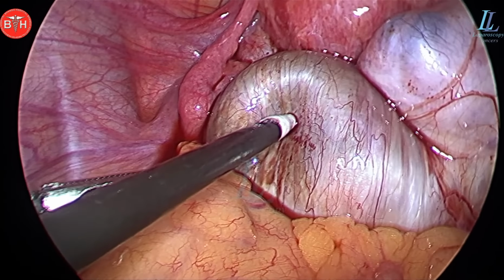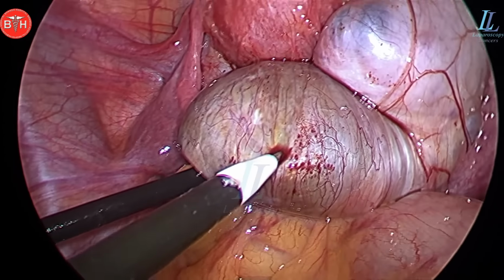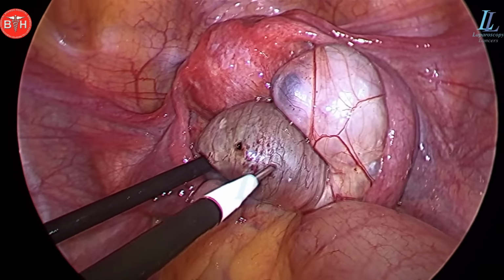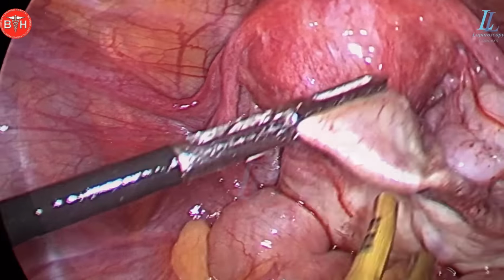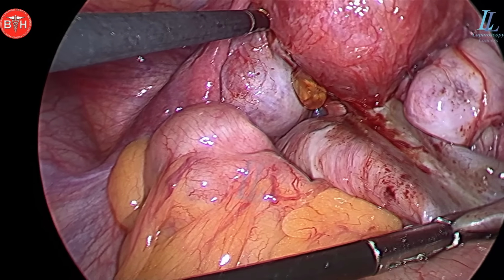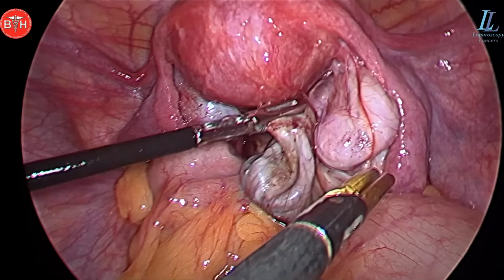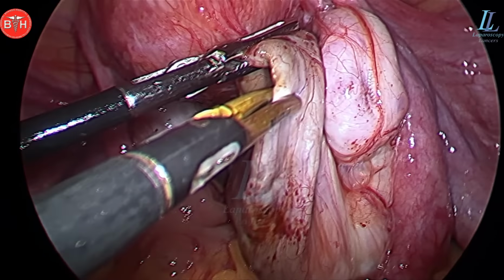The chocolate cyst is a very thick cyst, as it is the blood that has been marinating the tissues inside, and it's the chocolate. And what is this endometriosis thing? A disorder in which the tissue that normally lies in the uterus grows outside the uterus. That means the endometrium is secreting somewhere else, where it could be the fallopian tubes, the ovaries, the intestine, the peritoneum, and anything in and around the uterus. Sometimes in operative scars also they tend to stick and cause lots of problems.